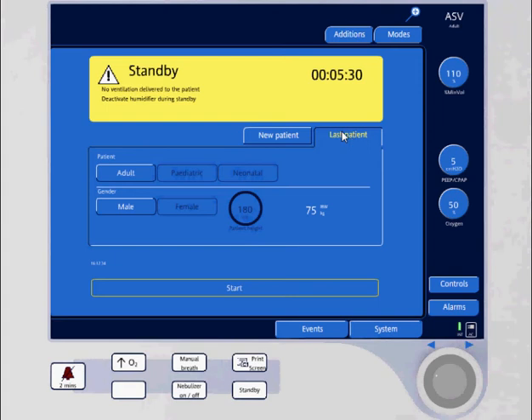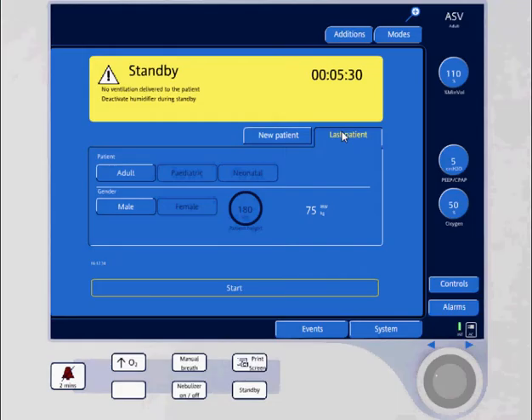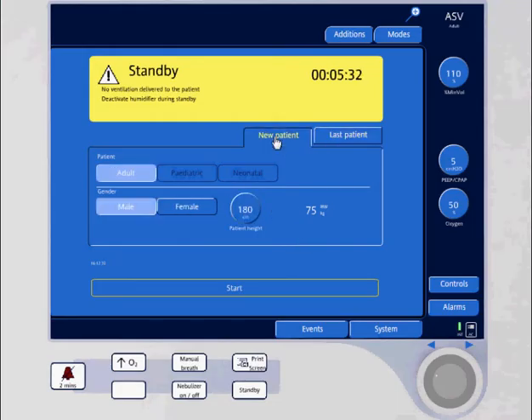The following video demonstrates the initiation of adaptive support ventilation from the standby screen. I'm selecting a new patient right now, and it's already selected adult patient male.